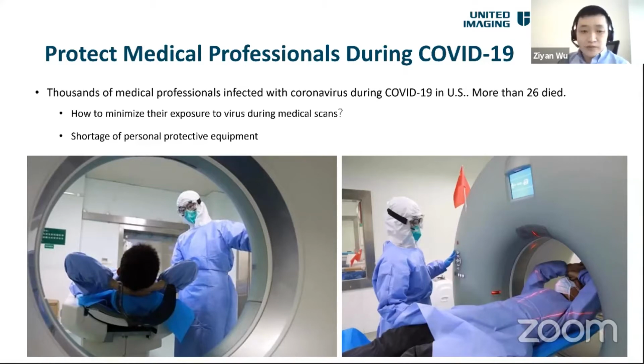For example, the technician has to guide the patient to pose on the patient support. And then, once the patient is in position, the technician has to determine the scanning parameters, for example, the starting position and end position, and also the bed alignment based on the observation of the body shape and the pose of the patient. So there are lots of physical interactions involved in this process.